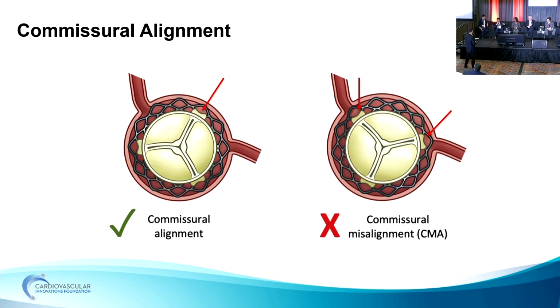I think getting the ECMO ready is very important. But as you said, he's still talking to you. The STs are not yet up. He's not even having chest pain. So it really makes sense to quickly go forward with a supportive guide, because if there is leaflet obstruction, then you're going to need support. You're going to need some advanced wiring. For sure. Yeah, I concur. The patient's relatively stable. You're ready, just get the guide in there and get a wire down and get flow. Of course, call for help.